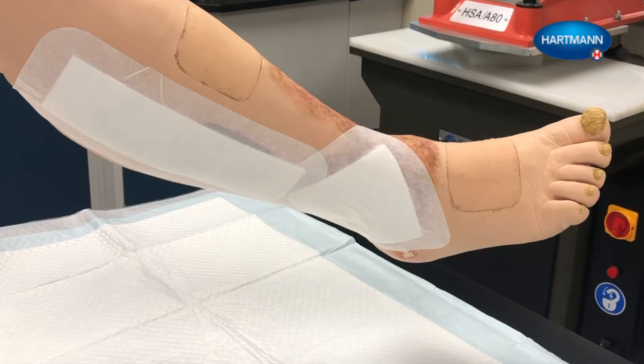Next, measure the ankle circumference. If the ankle circumference is less than 18 centimeters or 7 and 1/8 inches, pad the ankle and bony prominences completely to protect against excessive sub-bandage compression, which can cause tissue necrosis.